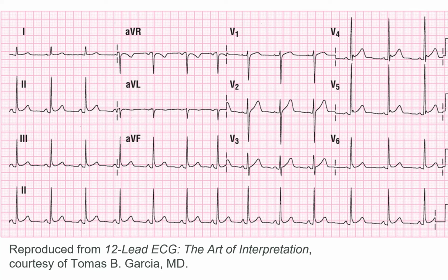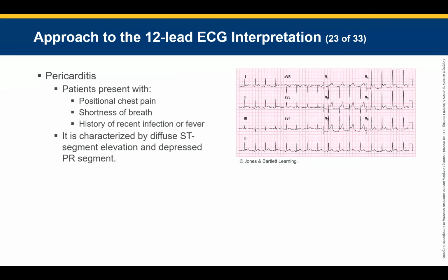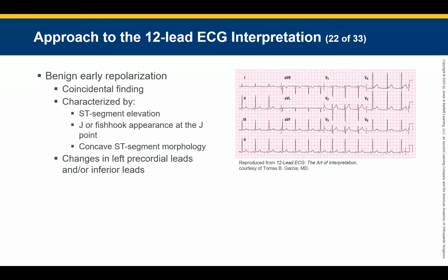It's hard to tell. I'd say we don't when we look at this as the baseline back here instead of this. Look at that as the baseline. Gosh darn it. Can't even draw that from here. That's the baseline. When you look at that as the baseline, it's not great. Okay? What we end up having here is called benign early repol. Come on, Dane. Catch up to me. Oh, that's terrible. Pericarditis there. I went too far. Benign early repol. Okay? Because I had already brought it up, so I went to the next slide. We get this U-ing across, and then we're going to put it up here, STEMI mimic. You guys understand why this could be a STEMI mimic?